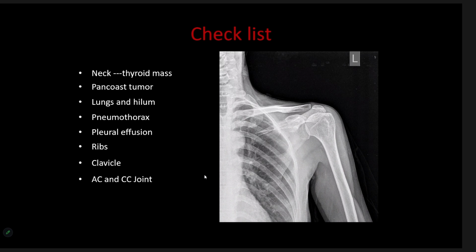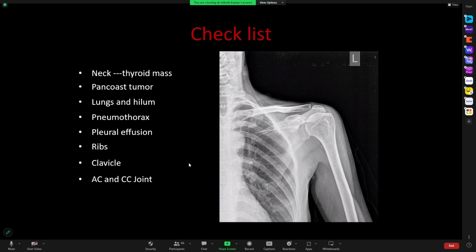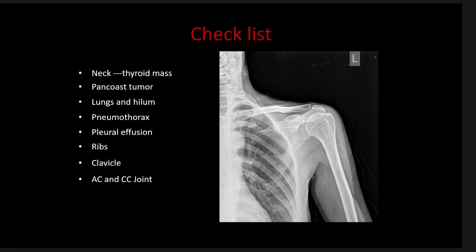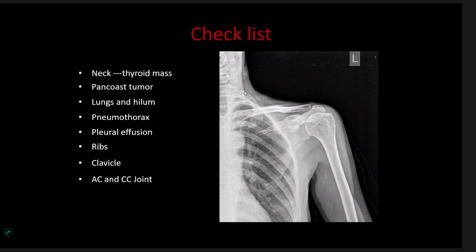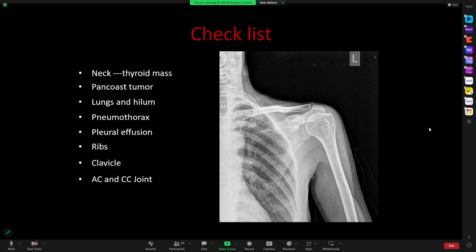Yeah, one thing I would like to add, Dr. Sandeep: two findings can be possible, for example, rib fracture and pneumothorax. I agree, so those are accompanying findings. Another example is joint effusion with fracture, intra-articular. Those are one or two exceptions where we should always keep in mind that two pathologies can be present. I agree with you. But still, I would consider them a rarity rather than common.